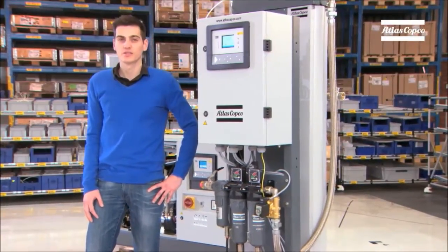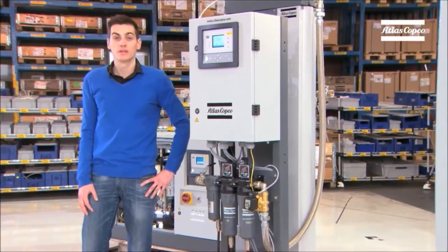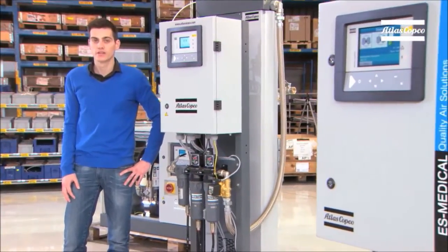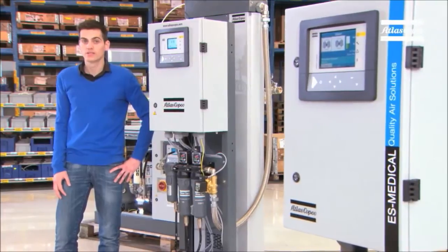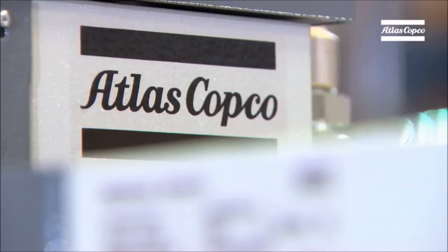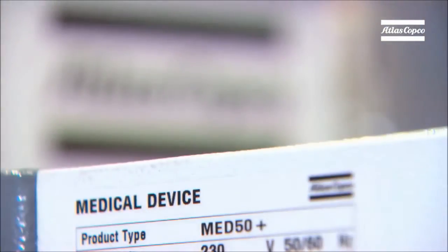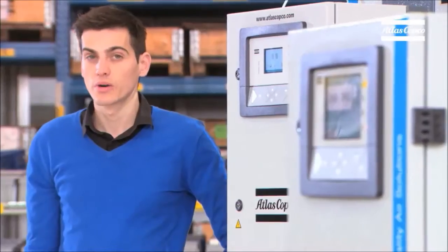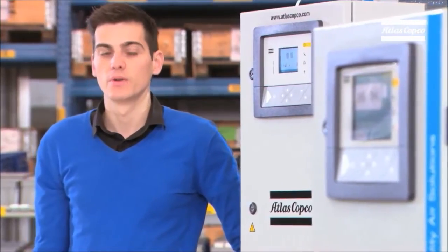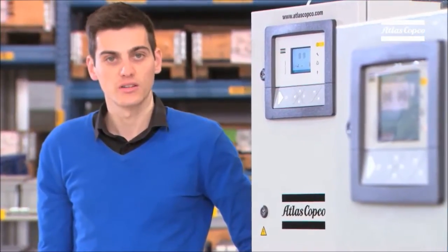It is the first Atlas Copco medical purifier that can be managed remotely by a central controller. In this concept, we only run one purifier at the same time, which ultimately saves on consumables and reduces the amount of service interventions. This purifier is also certified as a medical device — that's no surprise, because it delivers air of the highest quality. It does so by implementing seven steps.